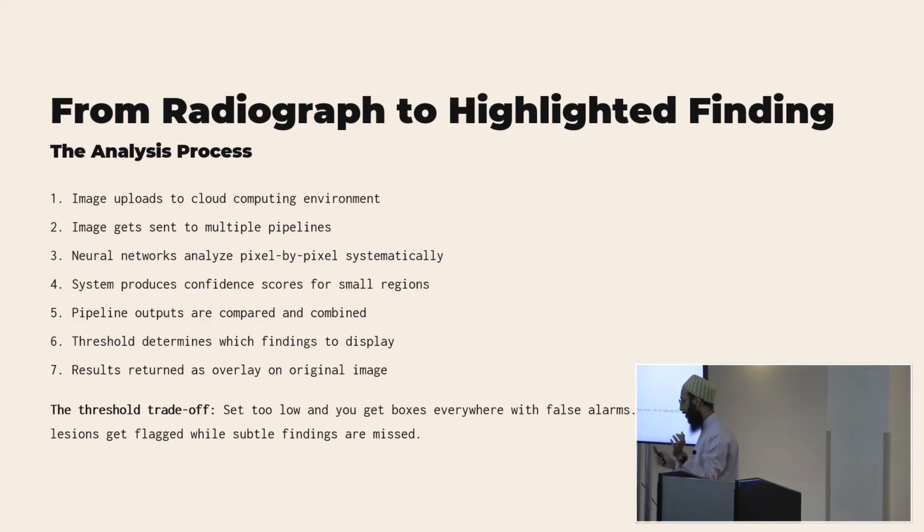And along with the brain concept that I put earlier, the confidence thresholds matter, right? Each detection will come with a confidence score, like I mentioned. In the initial version of the product that we were putting out, we had a slider, actually this is available in the EU but not in the US, that said, hey, I want to see all of the pathologies that are detected with 30% confidence or more, 50% confidence or more, 75% confidence or more, and you could toggle that. But in order to get it cleared by the FDA here, we had to do clinical trials for every single percent that we offered in the slider.